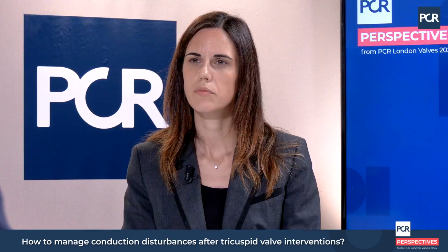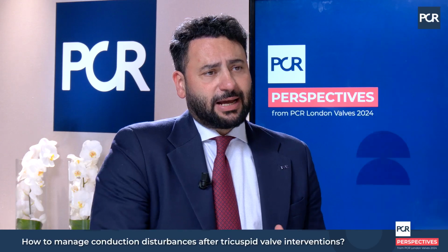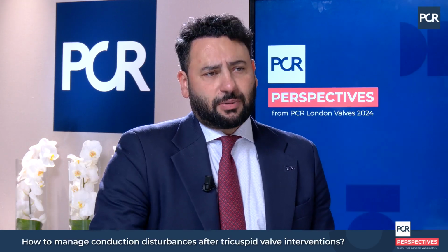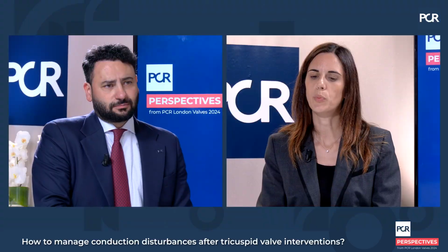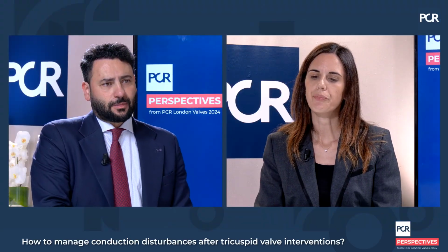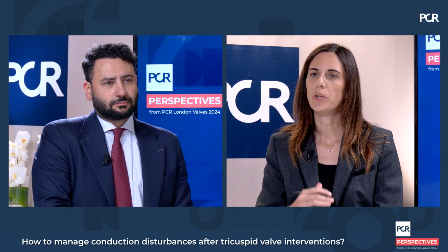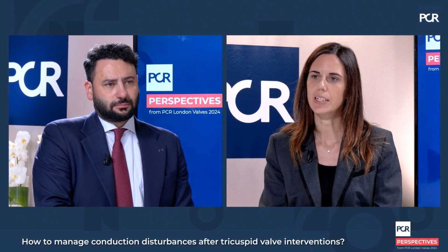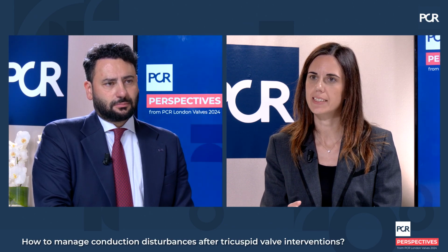Mm-hmm. And talking about monitoring, Marianna, how long do you think we should monitor patients after the implantation of these devices? That's a good point, because as compared to TAVI, for example, the onset of this complication is a bit late. It occurs later, generally hours or days after the implantation.